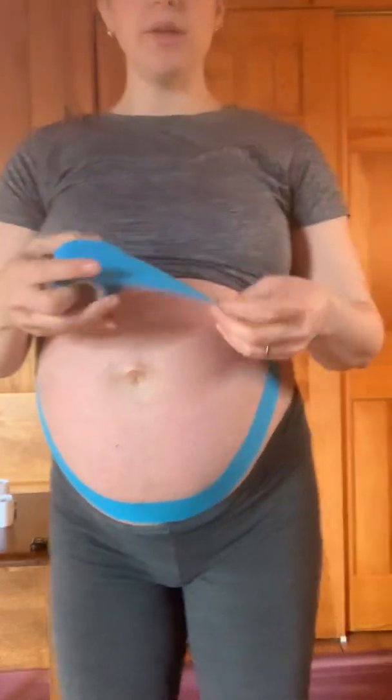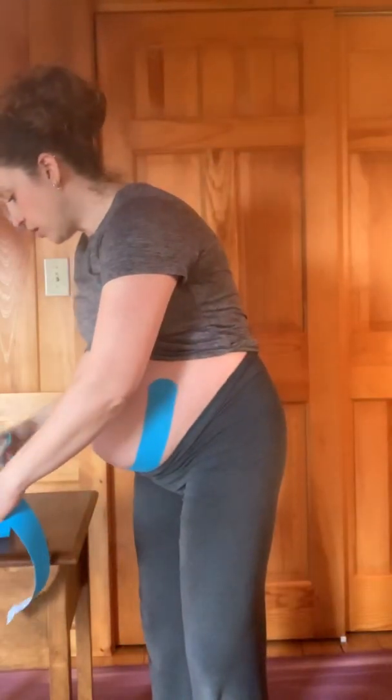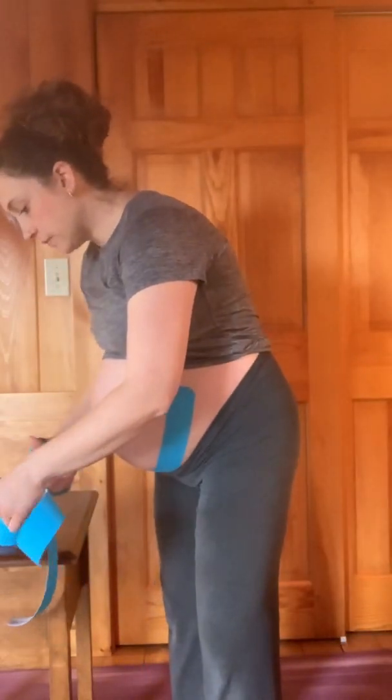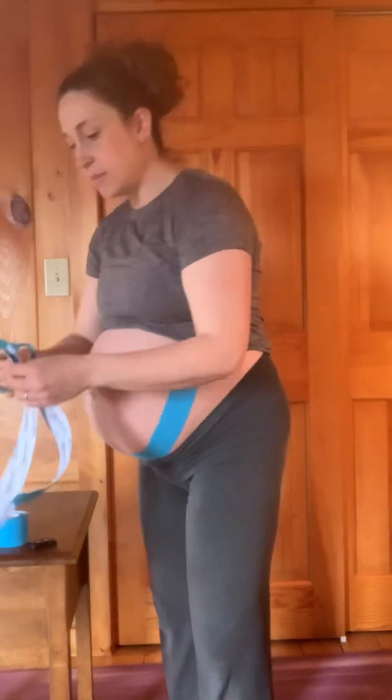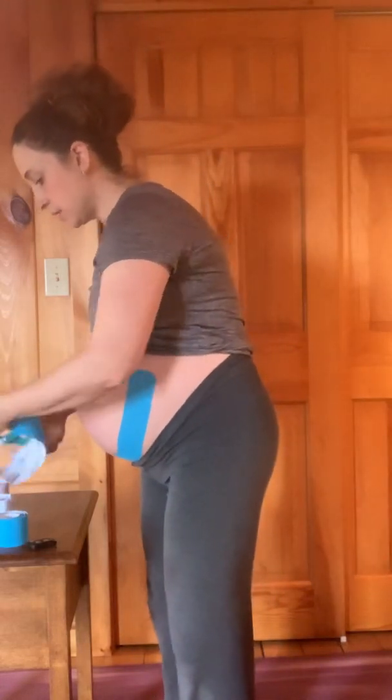The other two pieces we're going to crisscross, starting down low and coming across either side of the belly button. That's going to help support the abdominals and take any pressure off that you might be feeling in the center of the belly. The belly does need to separate some — the linea alba is the soft tissue that holds the rectus abdominis, that long muscle in the center, together. It does need to stretch to accommodate your growing belly, but sometimes it can be rather uncomfortable, so this will help take some of that pressure off.